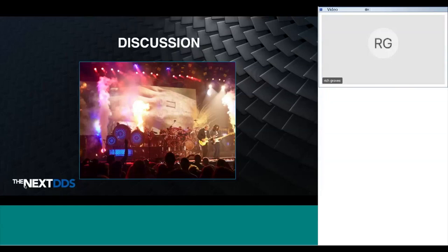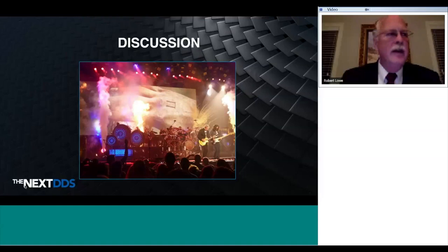Got it. Do you remove an existing restoration like that amalgam before or after crown prep? Well, that's a good question, and the answer is yes. When I've got an old amalgam that I placed, that I know I cleaned out, and now years later, for whatever reason, a tooth fracture or what have you, I'm not as apt to take it out immediately. I'll prep it, and if the margins are clean, I may elect to leave it if it's still a sound, marginally competent core.